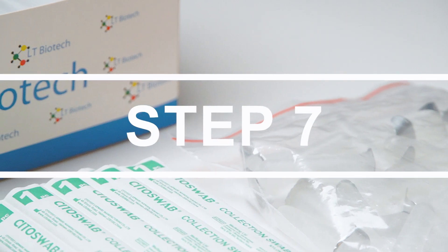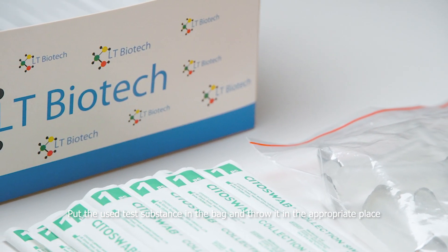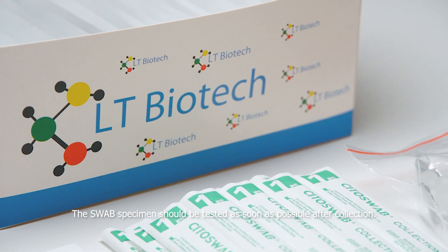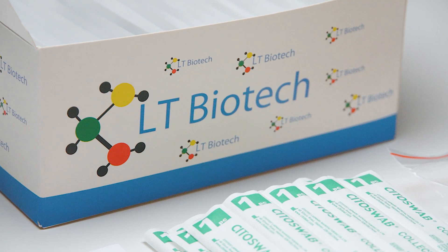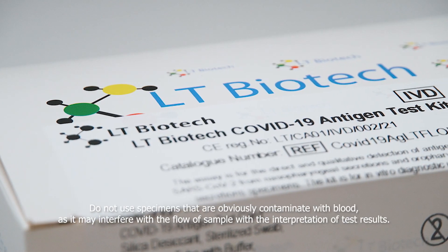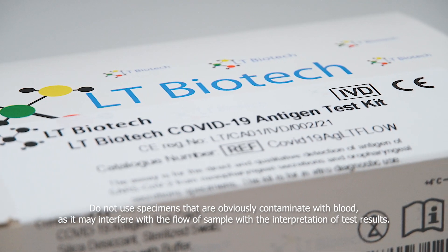Step 7. Put the used test substances in the bag and throw them in the appropriate place. Attention: the swab specimen should be tested as soon as possible after collection. Do not use specimens that are obviously contaminated with blood, as it may interfere with the flow of the sample and the interpretation of test results.